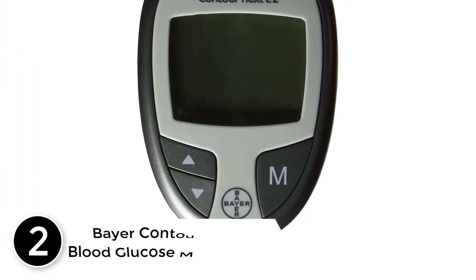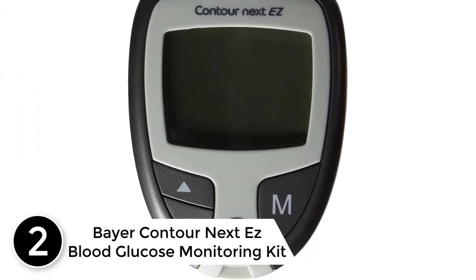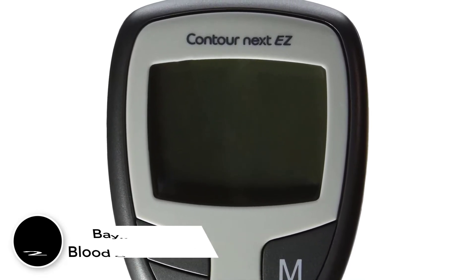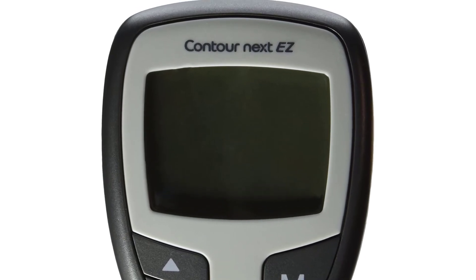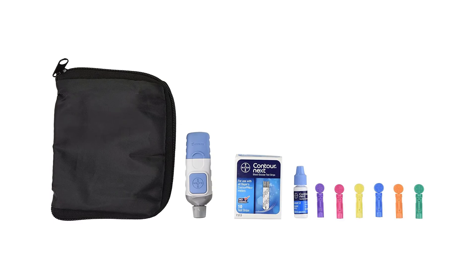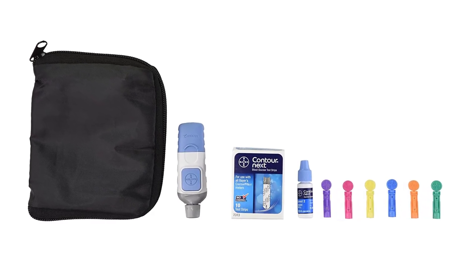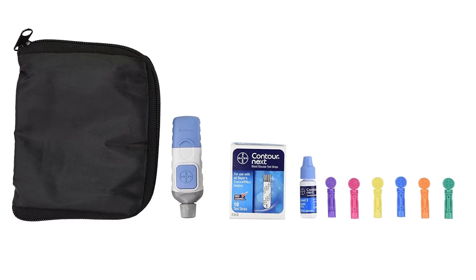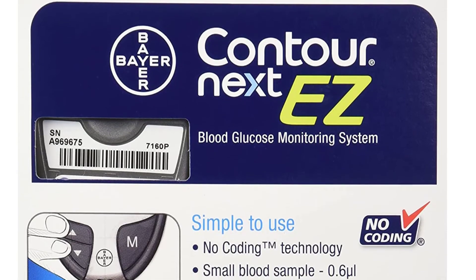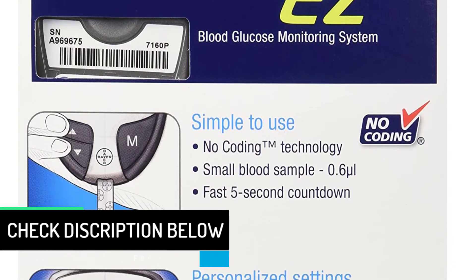At number 2: Bayer Contour Next Easy Blood Glucose Monitoring Kit. You will now be able to monitor 7, 14 and 30-day averages of your blood glucose levels in the comfort of your home. With no coding required for the testing process, you will easily be able to view the readings on the digital display of the device. The kit comes with optional advanced features that allow pre- and post-meal markers with adjustable alarms.